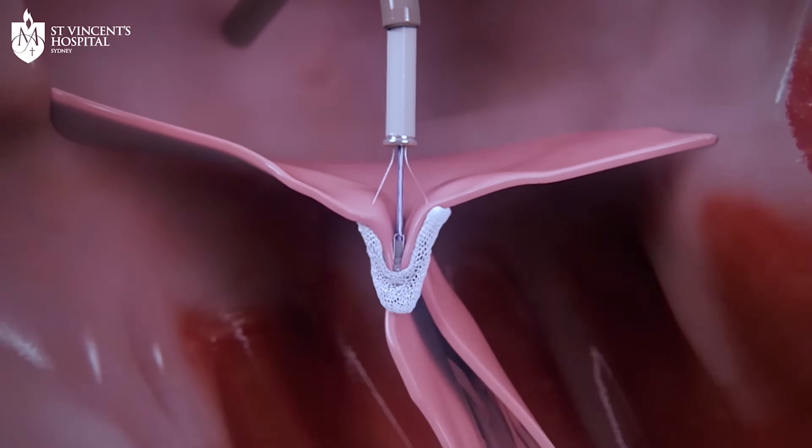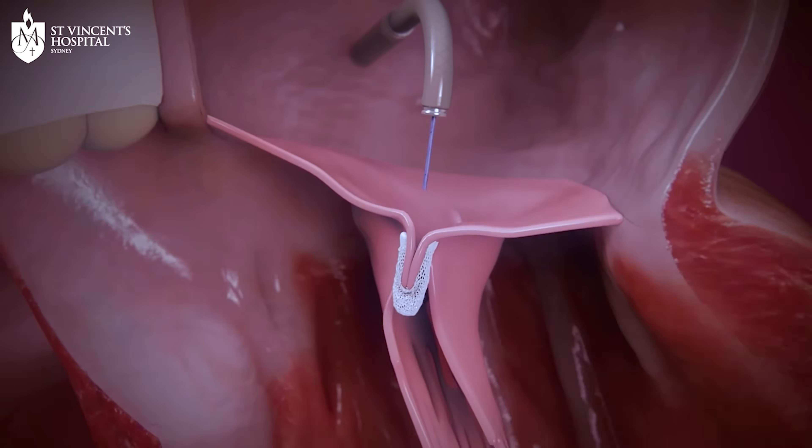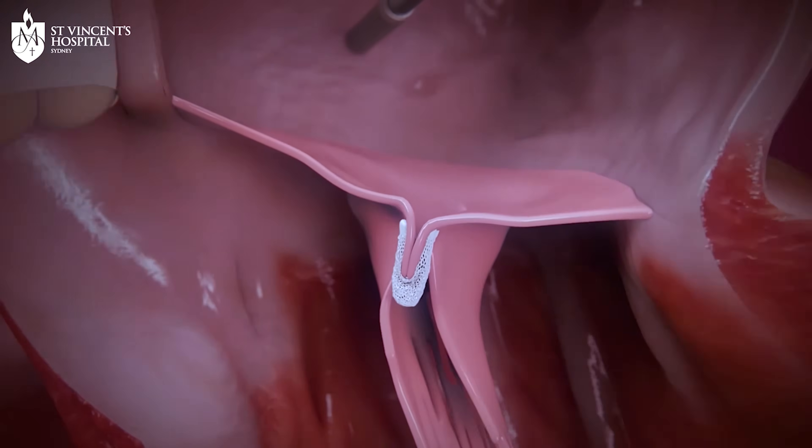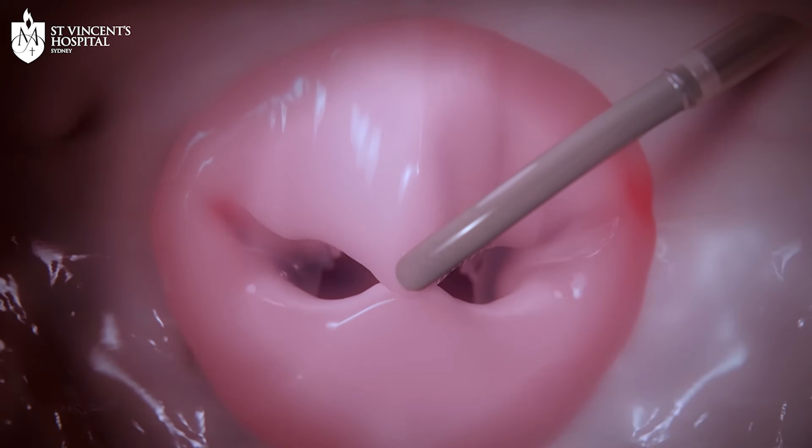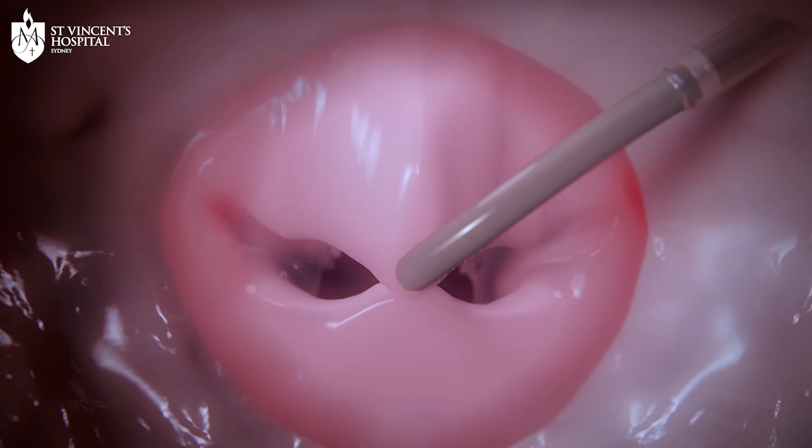Instead of the mitral valve having one large opening, by clipping the valve in the middle we typically create a valve with two openings, which allows the leaflets to come together to prevent blood from flowing backwards into the lungs.